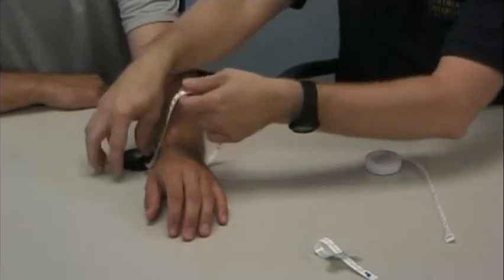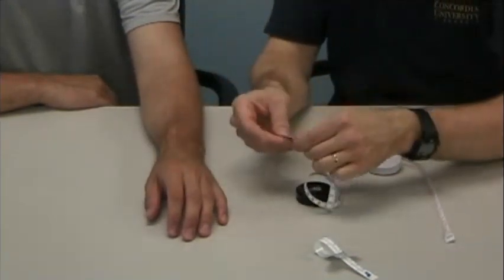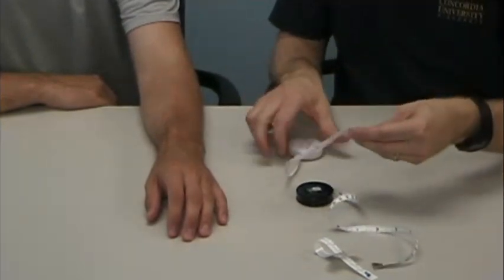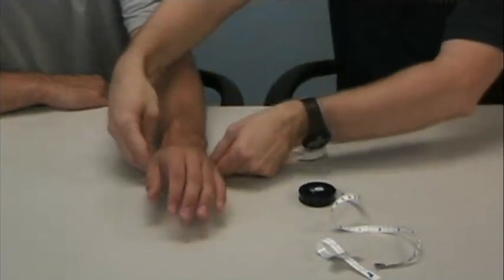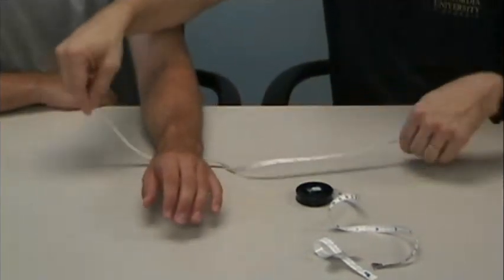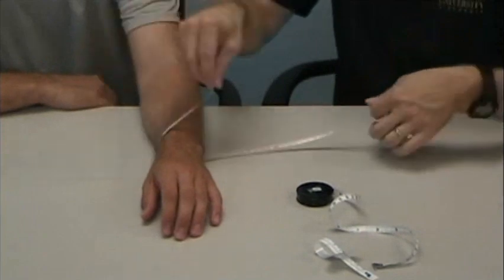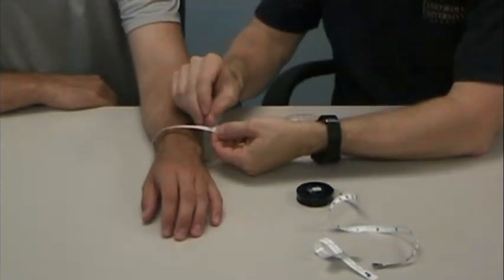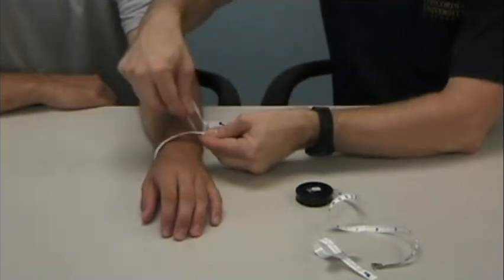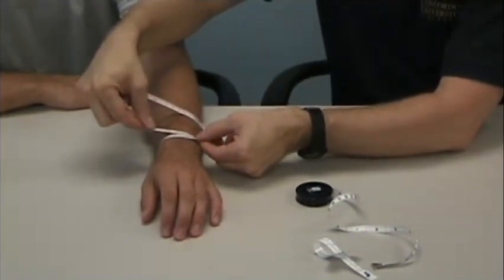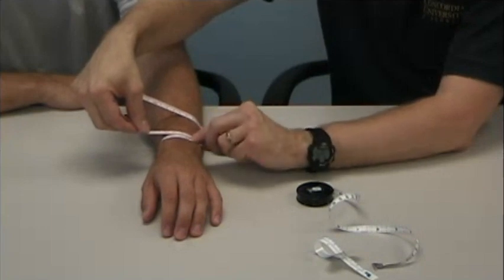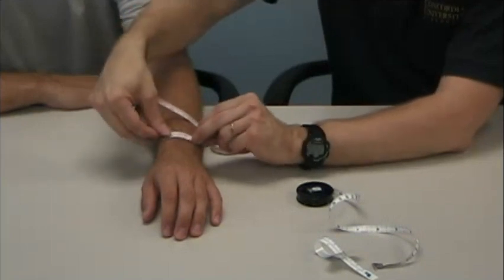Another way to do that—this is kind of a specialized tape measure; I don't see a lot of these like that. More standard, the flexible tape measure doesn't have that device at the end. In that case, what you're going to do is simply align the zero line on the tape measure up with the other end and use that zero line as your reference for where your measurement occurs.